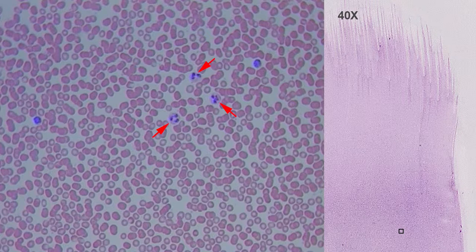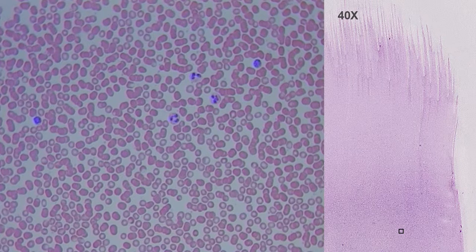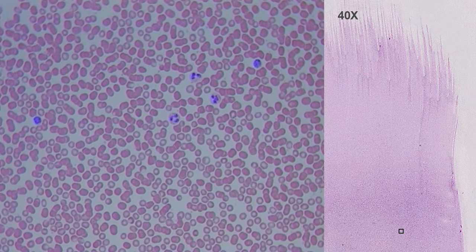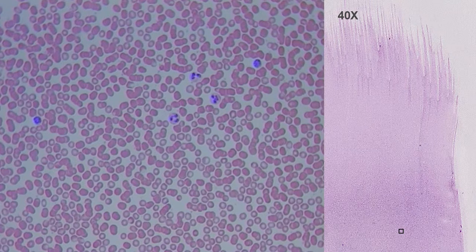Granulocytes, also called polymorphonuclear leukocytes, are characterized by the presence of granules in the cytoplasm. They are divided into three types according to the staining characteristics of the granules: neutrophils, eosinophils, and basophils. The most abundant in human blood are neutrophils, whose granules are not stained with this type of staining.